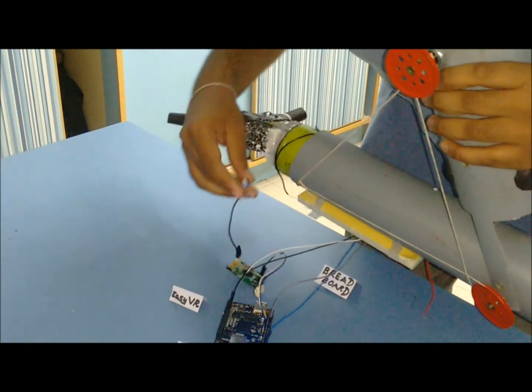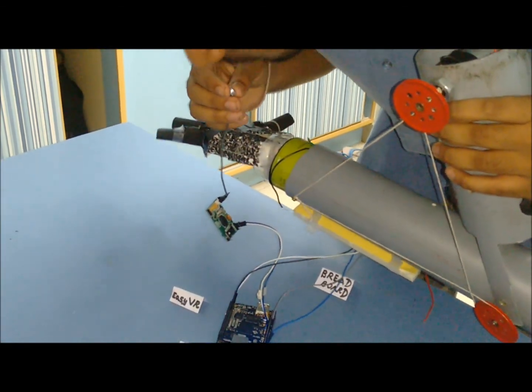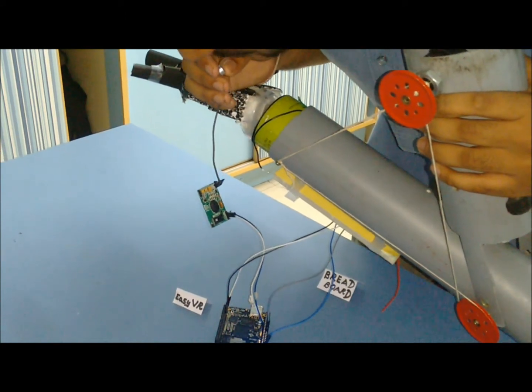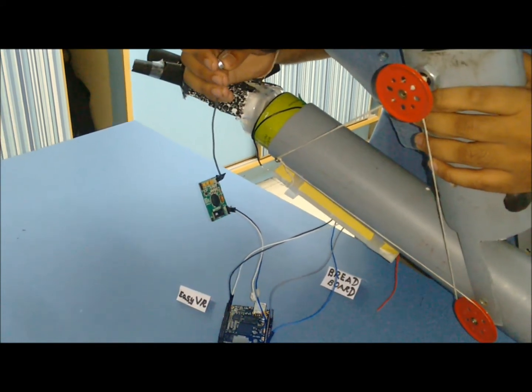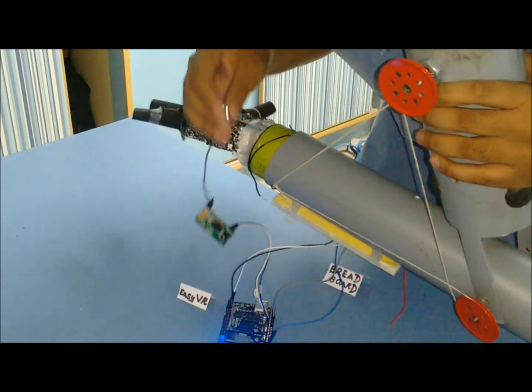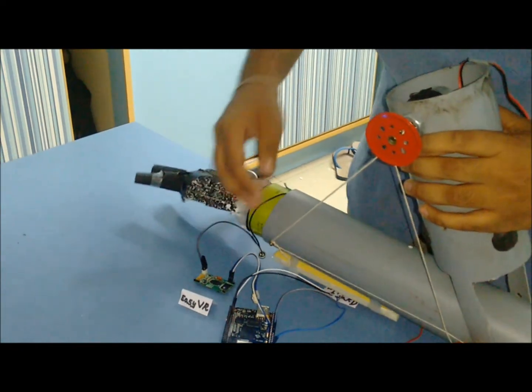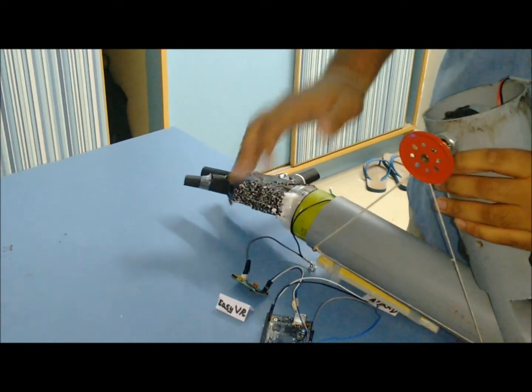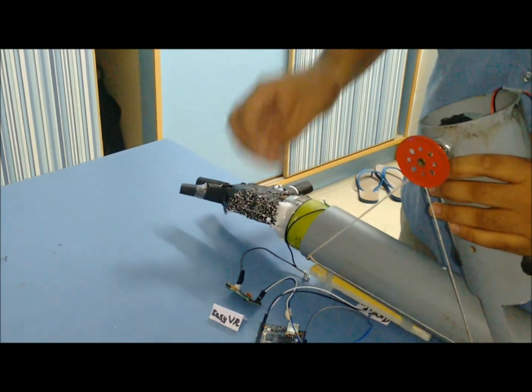Now when I say up, up, stop, down, stop. As you've seen here we have achieved the upward and downward motion of the prosthetic arm using the voice as an input.